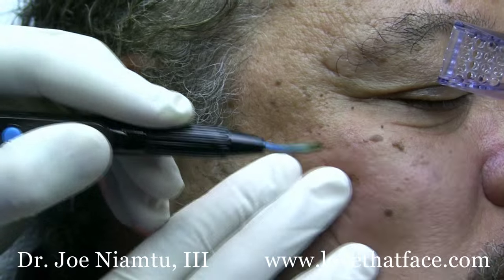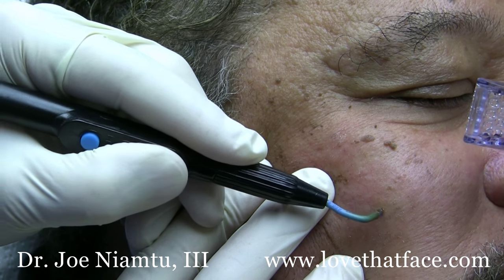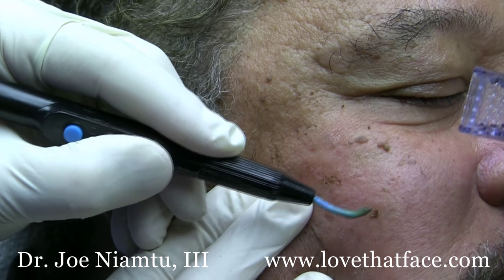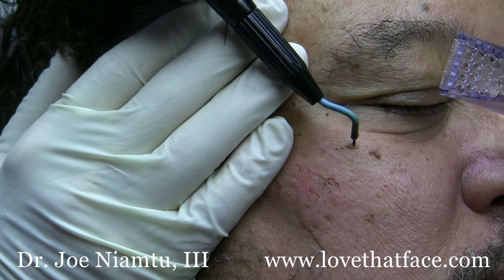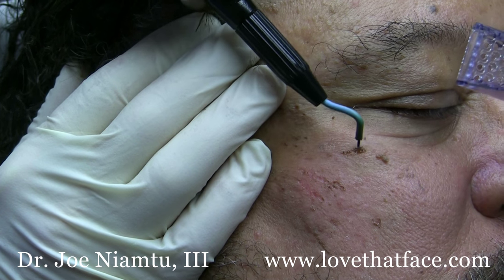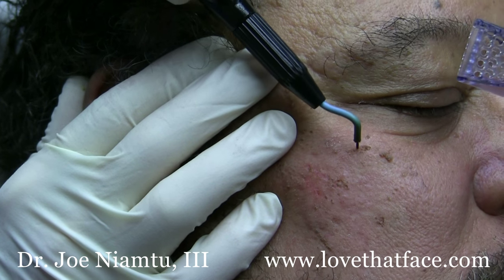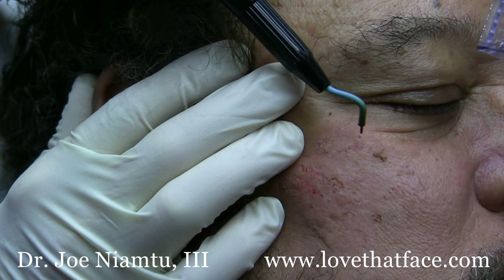If you use local anesthesia, then you can use a long dwell time on these lesions. However, when you're doing them without local anesthesia, which we sometimes do, what you want to do is just do really little short spurts — tap, tap, tap — enough to disrupt the tissue. These are not really deep and they wipe off quite easily. Most people can tolerate this without any anesthesia, however some supplemental local infiltration is also helpful.